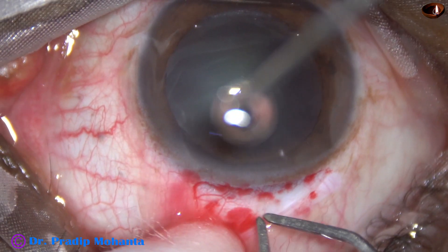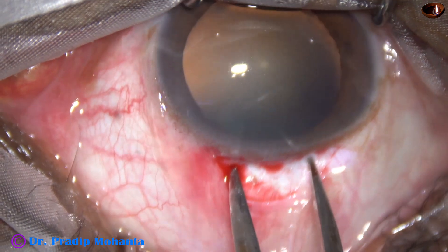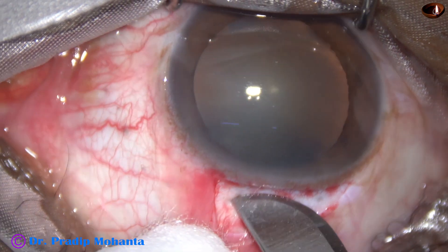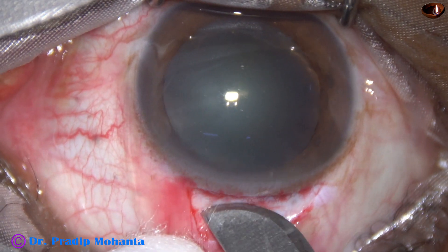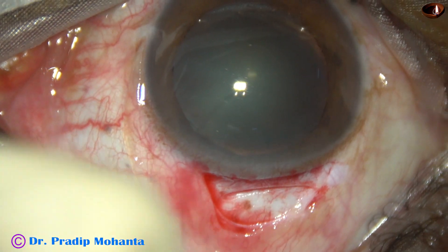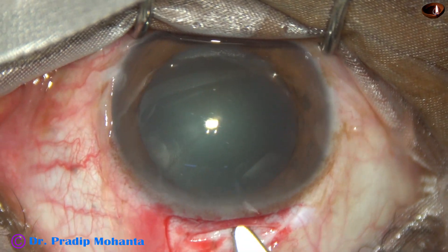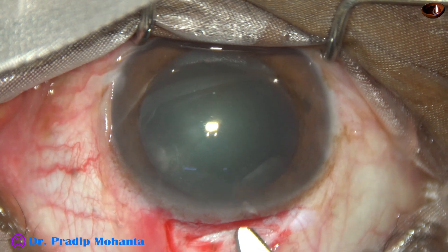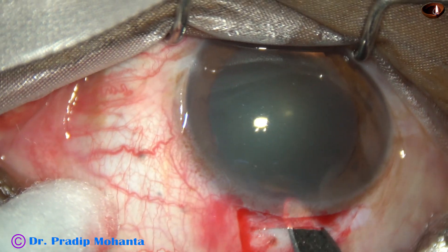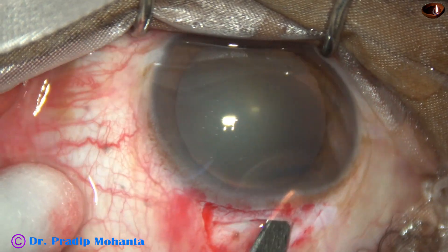By this time, peritomy has been done and mild cautery has been done. This is the 4 millimeter mark. This is a 15 number Bard-Parker blade, and I have made an incision of only 4 millimeters. Now I take a crescent blade and make a sclerocorneal tunnel. The inner incision is about 5 millimeters and the outer incision is about 4 millimeters.